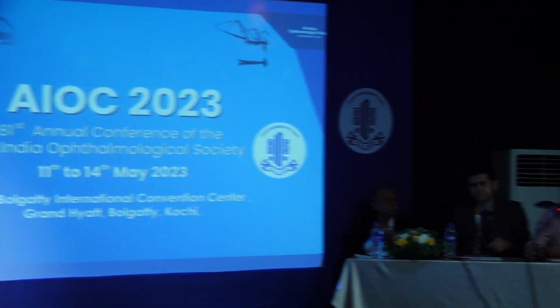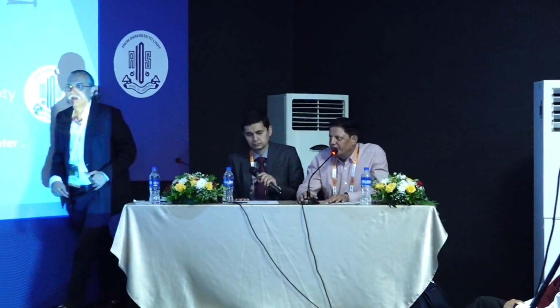Thank you, Dr. Ashok, for your excellent presentation. Just like to add two things only. One thing is the surgeon who operates, that matters more than the machine. And secondly, like you showed that last case, you were not breaking much the nucleus. Even if you break in small pieces, then you can just aspirate it. You're using less of the phaco power, even that will be a better option.